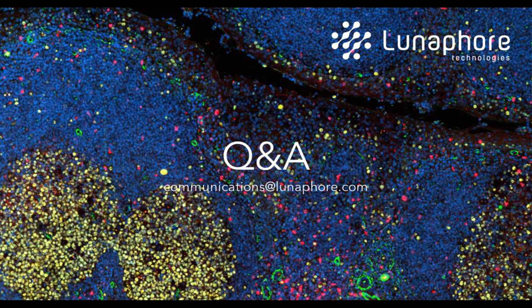Another question here is asking whether antigen retrieval is performed prior to this application or automated on the device. This is very important. So the antigen retrieval needs to be done offline, on another instrument, prior to being loaded into our system. But we are optimizing it with a module that is automated. However, the user can choose what method to use for the dewaxing and antigen retrieval. The way we're suggesting is using an instrument in order to get it automated.